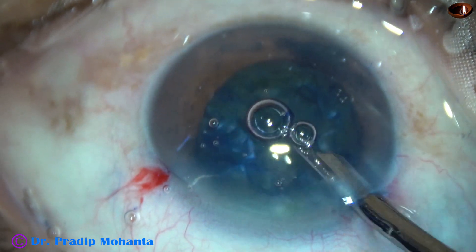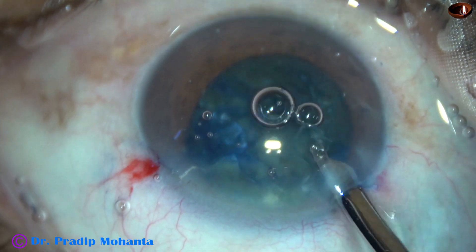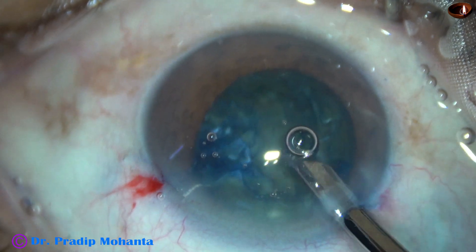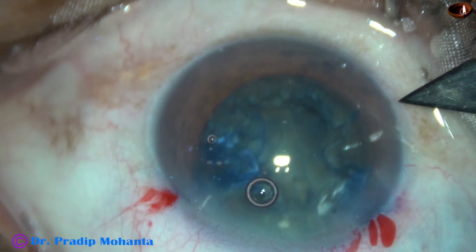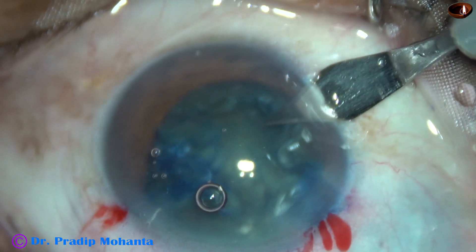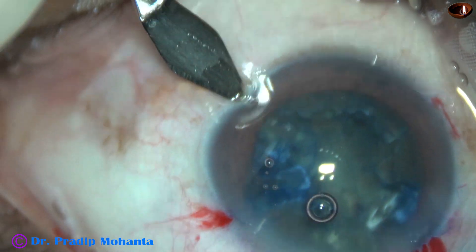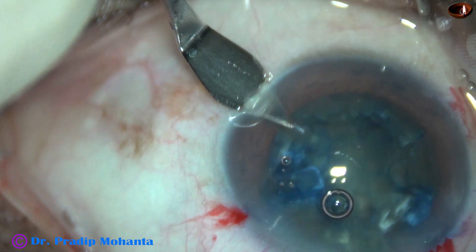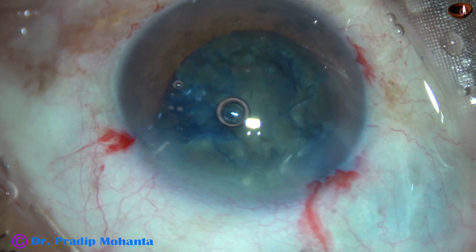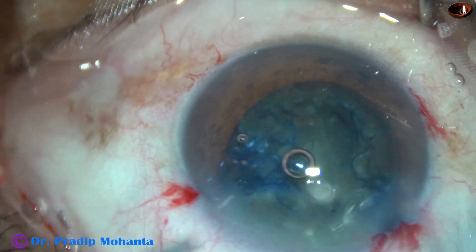And now I remove the excess dye, inject visco, and then make two side ports — one at 8 o'clock and another at 4 o'clock. These two side ports will be needed at various times. And now I am placing the capsular tension ring.